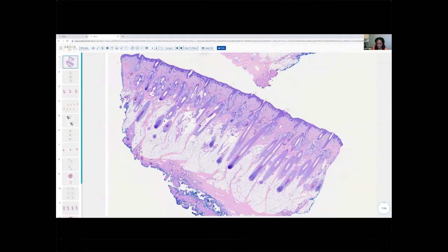And so the general standard for looking at hair is going to be to take a 4mm punch biopsy. So whether you're looking at it in vertical section or horizontal section, we like to get those 4mm punches. And so again, as I'm pointing out features here, we're really making a point about what we're seeing to inform our dermatologists. What features can help them to identify treatment points that are ultimately going to help the patient? What tools can they select in this often difficult to treat category of conditions?